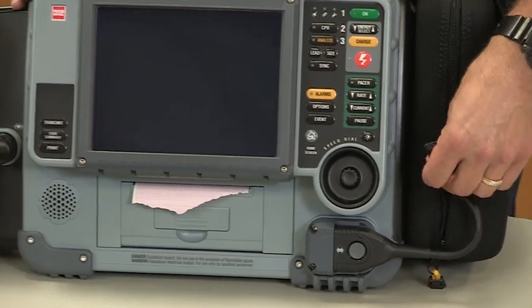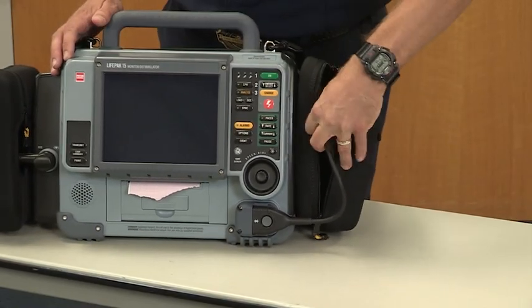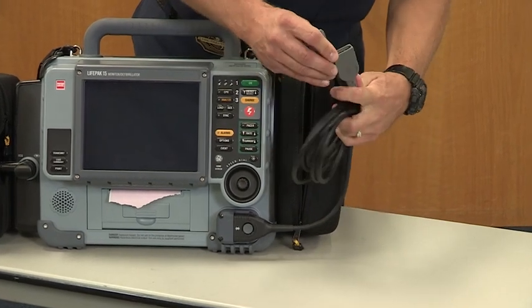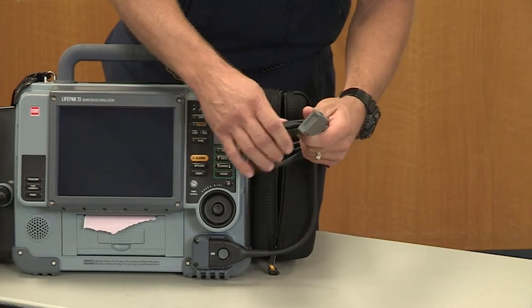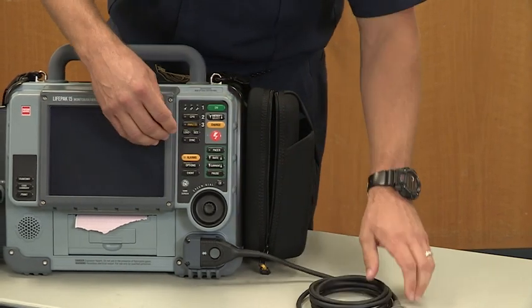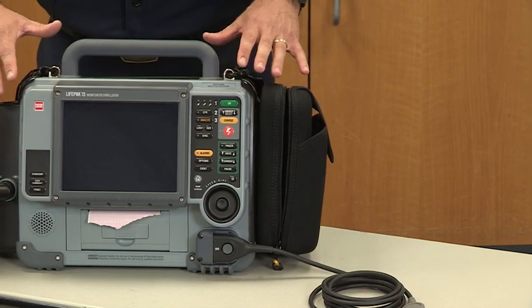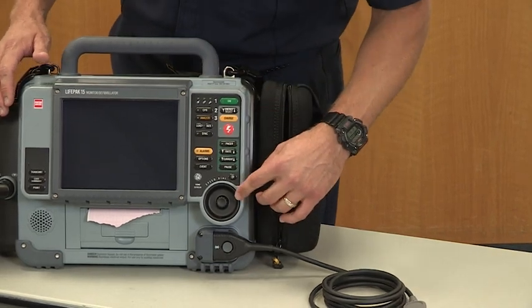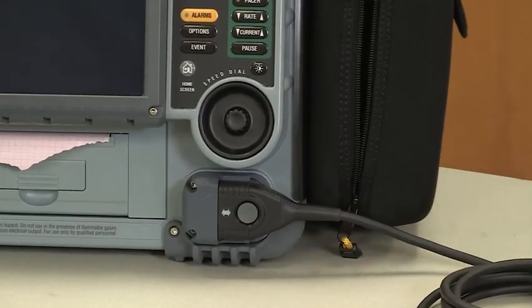One of the things we want to take care of is to not get any water inside any of the operating pieces, such as the end of the cables. You need to make sure these stay dry. It's best to just wipe these down with one of those hand wipes. When you wipe down the unit itself, if this got contaminated or dirty in any way, we need to make sure we don't get water inside the dial or inside any of these connectors as well.